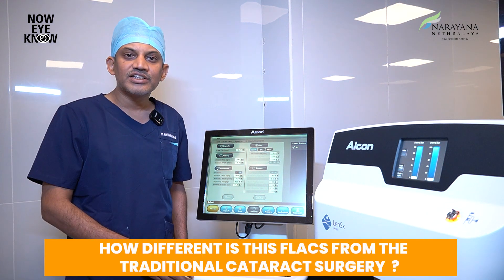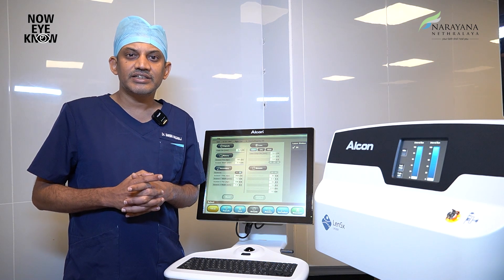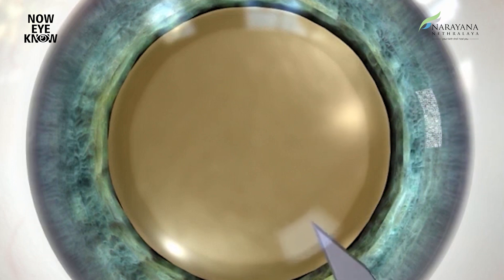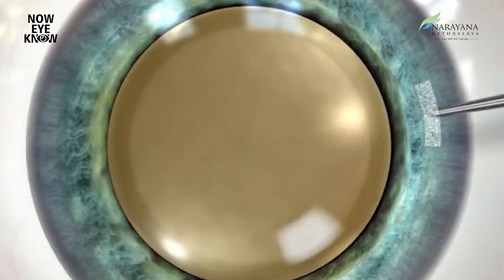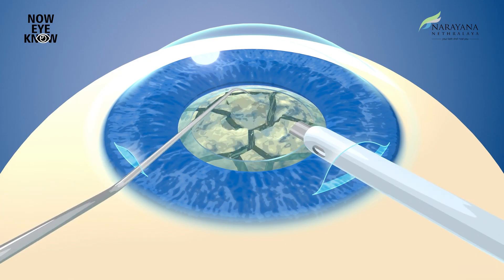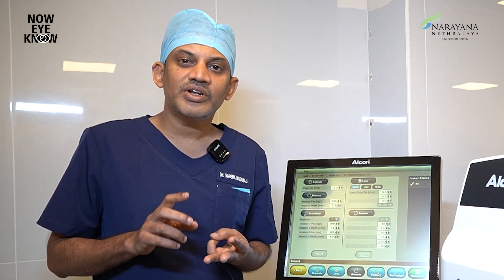To begin with, how different is FLACS from traditional cataract surgery? In traditional cataract surgery, also called PHACO, the first important step is making a manual incision on the cornea to enter inside the eye, done using specialized blades. The second step is making an opening in the bag that contains the lens, done manually using a sharp tip blade or forceps. The third step is removing the nucleus using ultrasound energy.